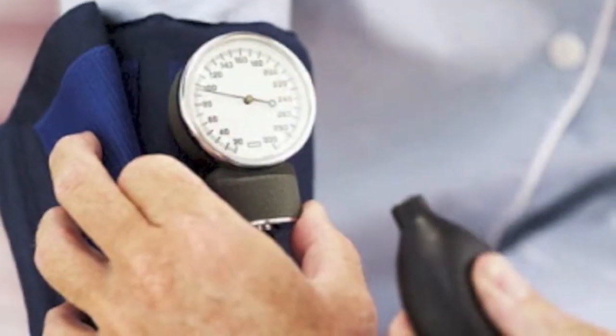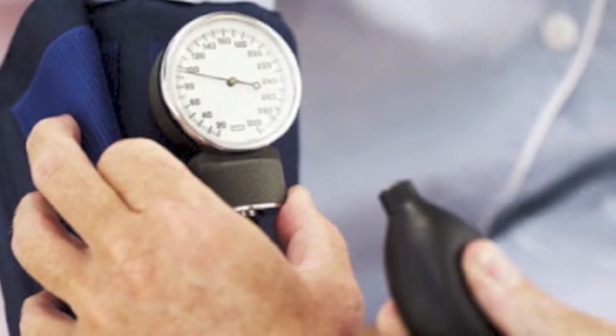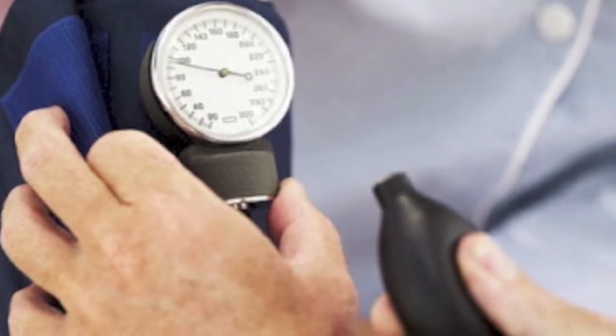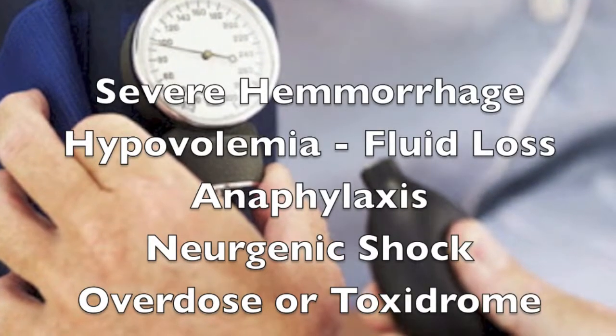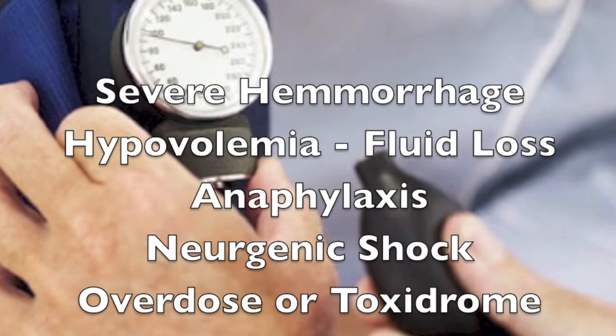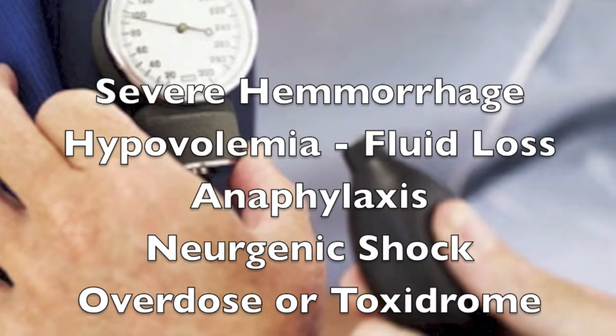Indications for use are any case of pathologically low blood pressure or impending shock where the systolic blood pressure is 80 millimeters mercury or less. These indications include severe hemorrhage, hypovolemia or fluid loss, anaphylaxis, neurogenic shock, overdose, or toxidrome.